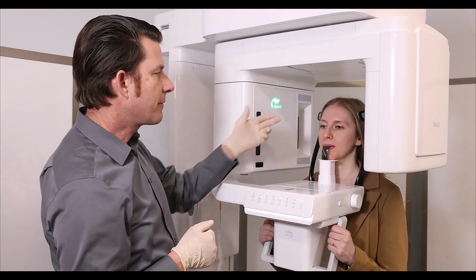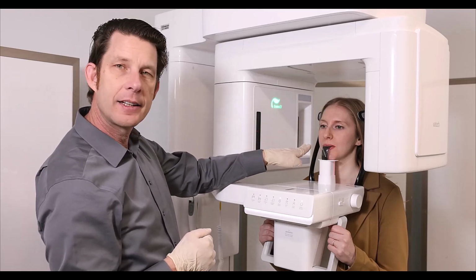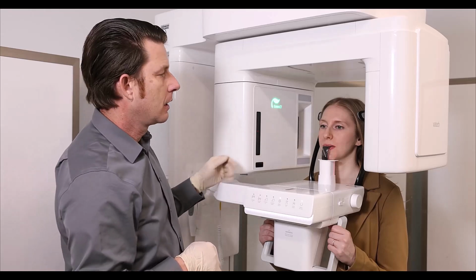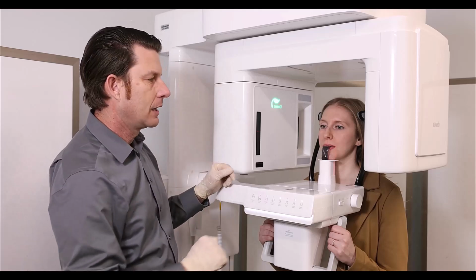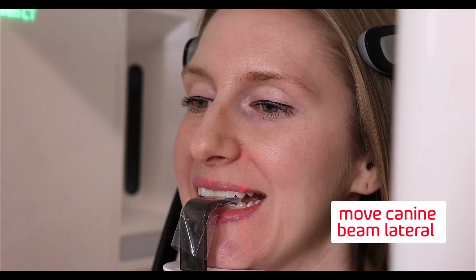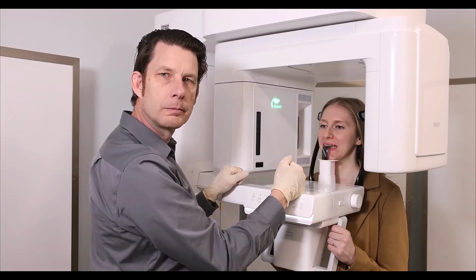So you can see here I've got the patient lined up center with the mid-sagittal beam, the occlusion slightly tipped down. We have our Frankfurt horizontal beam top of the tragus to the infraorbital notch of the eye. Our temple supports have been closed and snug on the patient's head. Lastly, we're going to look at our canine light. Smile really big for me. And we're going to move that to the lateral, just basically moving that further forward to our lateral.